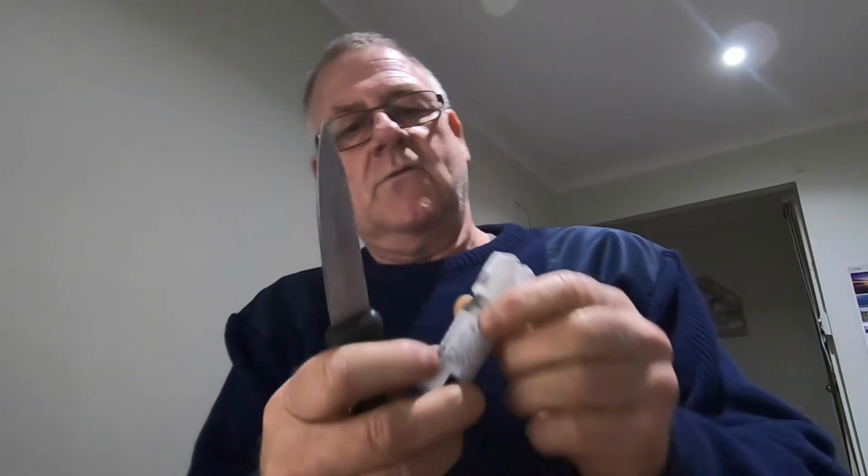And I'll show you exactly what I'm doing. Once you slice it off, it's just a tight band. There's a lip round here with a tight band, and you just have to pop that out. I wouldn't try and cut through it in case you cut into the canister and then you've ruined your inhaler. But once you cut that off, just another wee bit pries out, and it should be ready to go. There. So once you cut through that, pull that off, and there you go, your old style inhaler. Pop it in there, and it works.